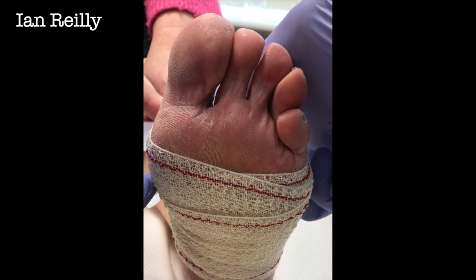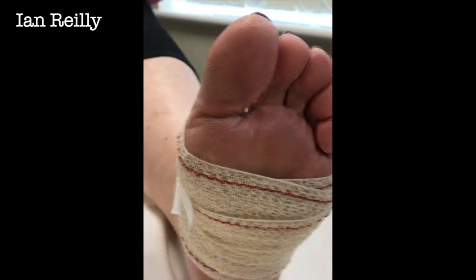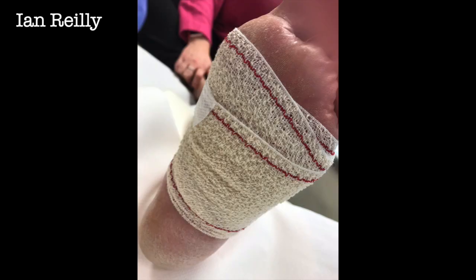Awesome. Put that there. Got it. And then what I'll do is I'll stop that video. Bit of an overkill for a dressing, but there is a chance they'll bleed. So a bigger dressing's better than a smaller one.